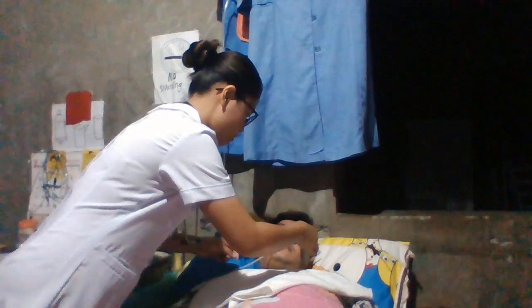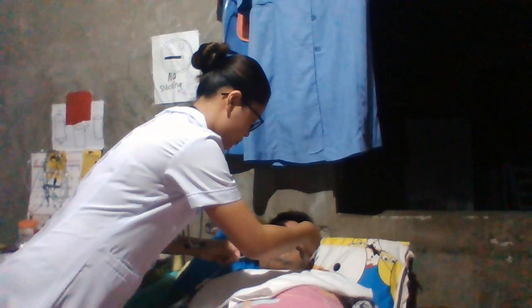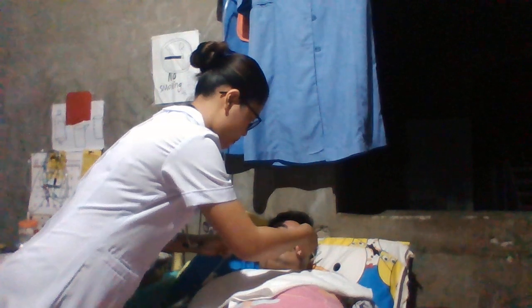Excuse me, sir. I'll just remove this one. And then afterwards, we're going to remove the nasogastric tube. But before that, we are going to put on gloves for our safety.